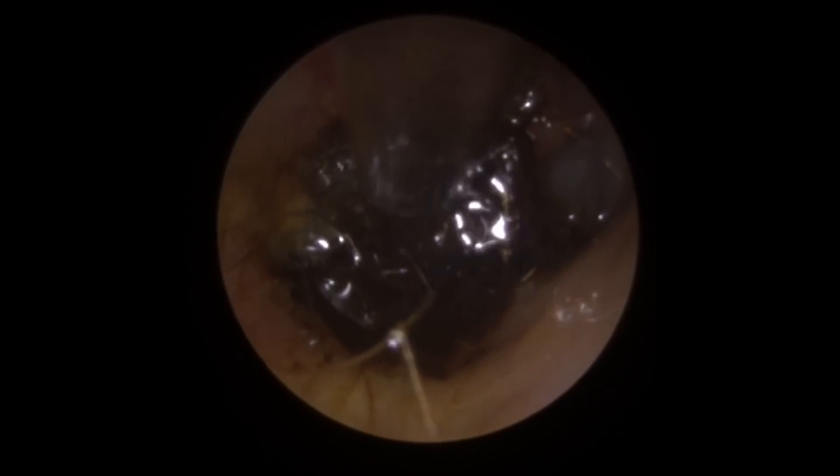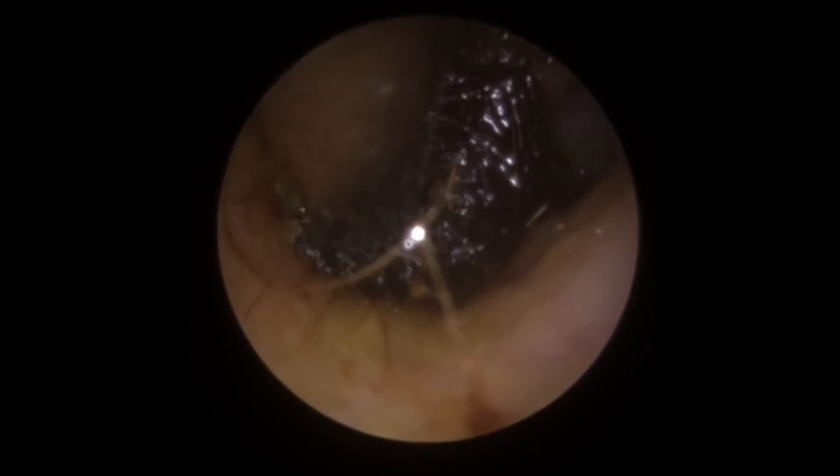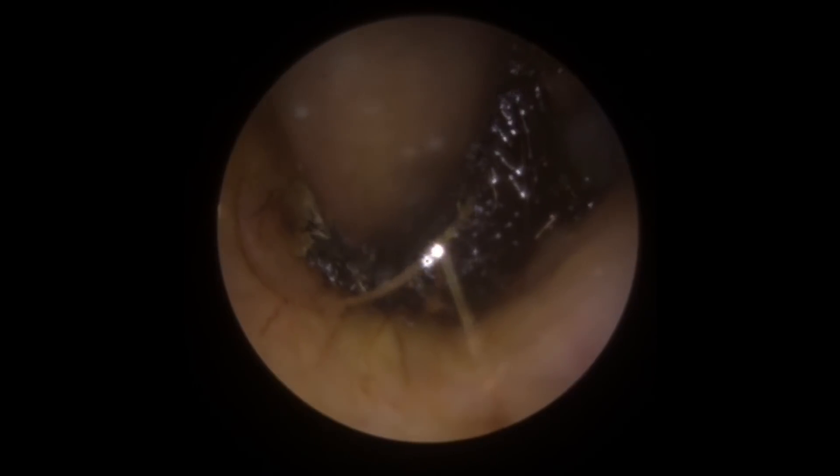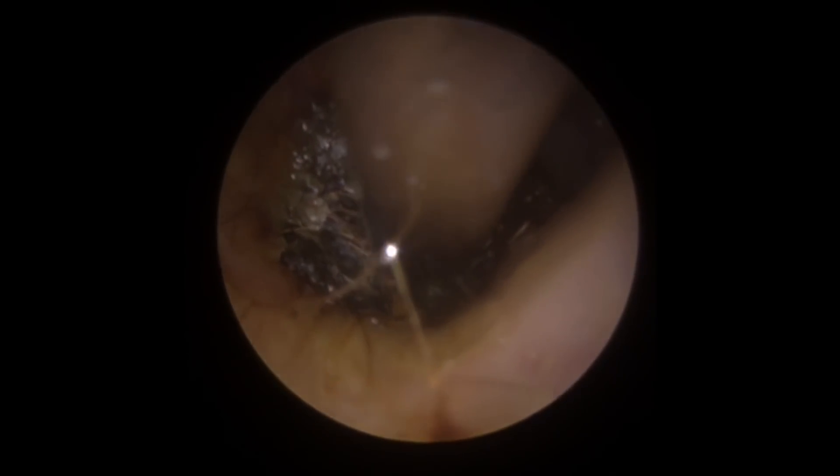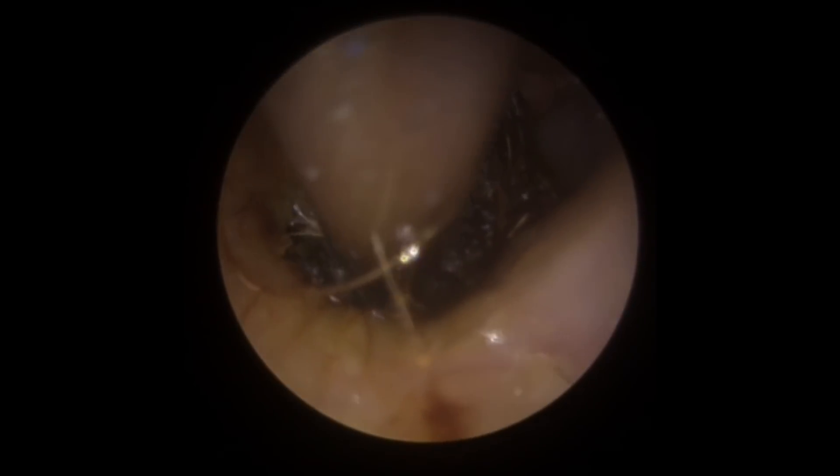We've introduced a little bit more olive oil in here to see if we can loosen this off a little bit more. You can see the olive oil has managed to get down to this piece of wax and it is working around the outside edge, but it's still quite firmly attached — really really jammed in there.